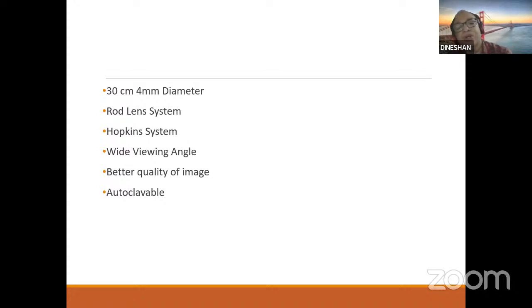About the 120 degrees. In the olden days when we were all trainees, the standard question was, which is the blind area of the bladder? And the standard answer is the anterior wall close to the neck. So that was the blind area. And to visualize that area, you needed this 120-degree scope. Now with the introduction of flexiscopes, it's not a blind area. So I don't think anybody will buy a reverse viewing scope, the 120 scope, for these things. So that is the angle of vision.